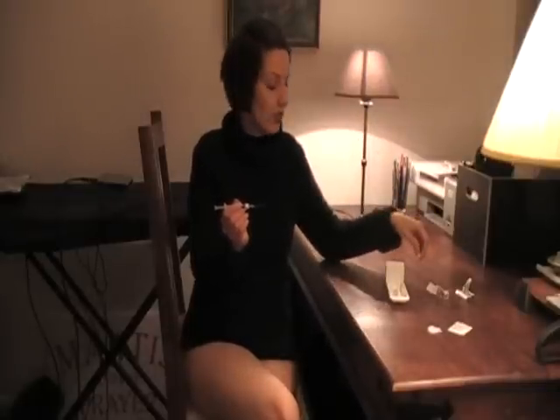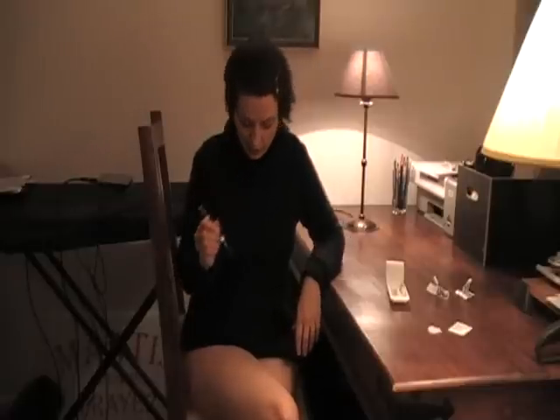When you're taking the cap off, make sure that you take it off and keep it away from your other hand, because you don't want any bounce back — especially if you have spasms in your hand. Just be careful that you remove it with a long stroke, putting it somewhere else. So here we are, 90 degree angle. Here we go.